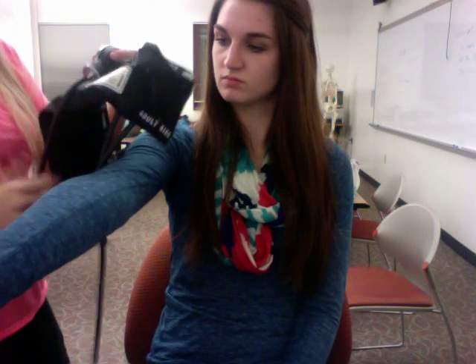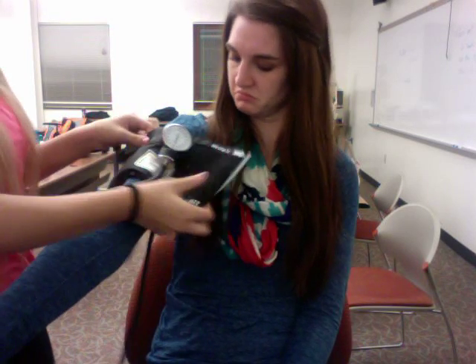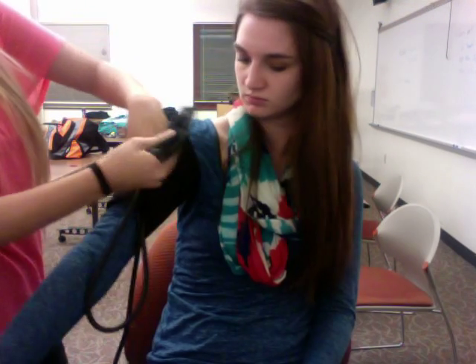When palpating a blood pressure, you must put the blood pressure cuff on the patient. When applying the cuff, make sure it fits snug so that it's not able to be pulled down or where it falls down the arm.